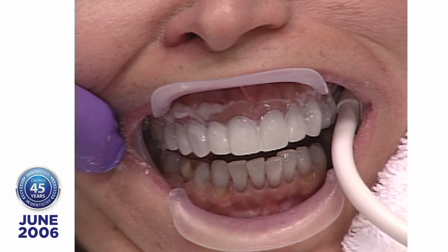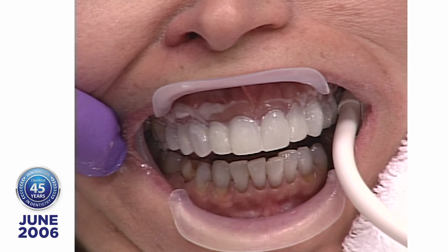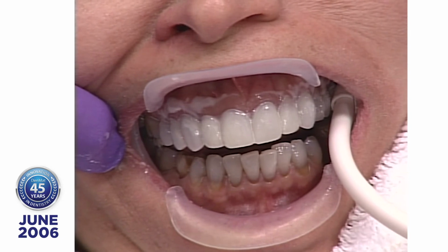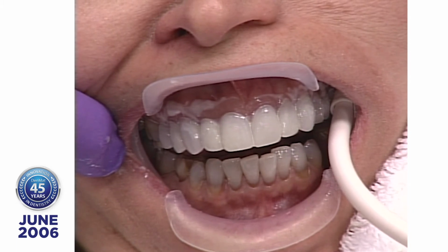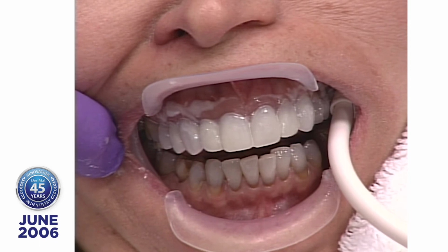We're stopping right here because in this period of time of mixing the Ultrabond and the Tenure AB with the Tenure S involved in it, it's now polymerized. So she's making some new. So even if you don't get the light on there, you're getting a lot of polymerization take place. But it won't discolor because it's a low level.